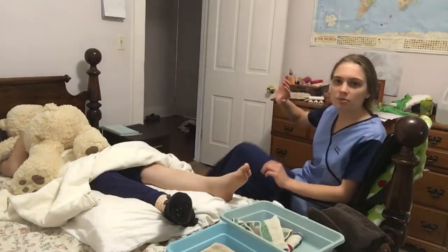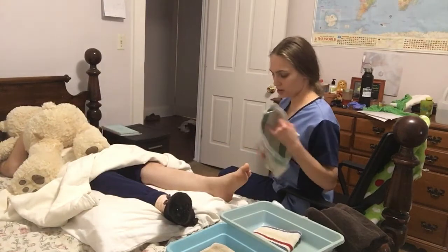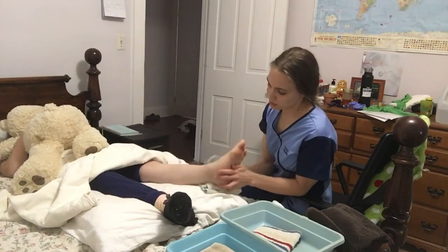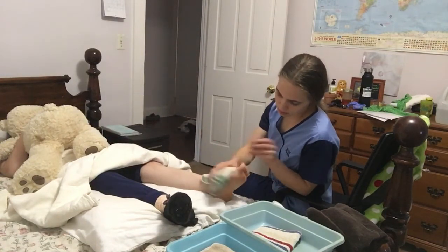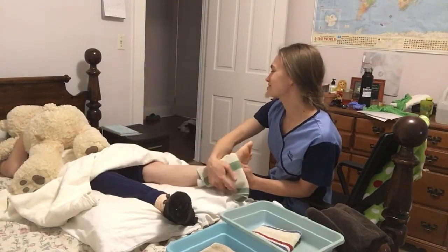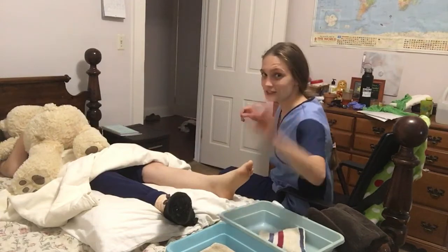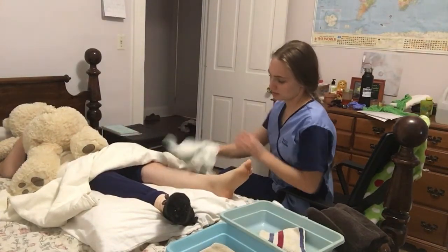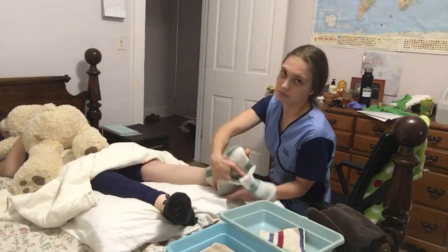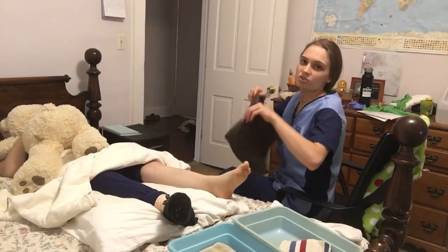So I'm going to raise the bed to a proper working height and I have my patient's leg here. First of all, I'm going to wash the legs. I have a soapy wash rag here. Be careful not to get soap between the toes. And then I have the rinse wash right here — I'm going to rinse it off and then dry it.